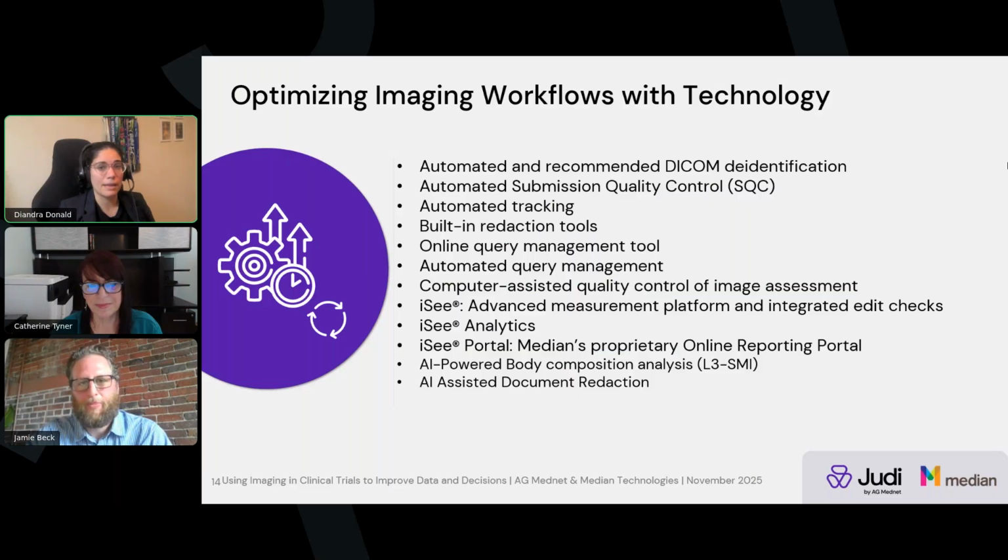So it may be that we had received a scan, but it's not listed within that clinical database yet for us. So in that case, it flags to us that the site needs to update their clinical database. So then we can ensure that the images we have received are images we are meant to be receiving.